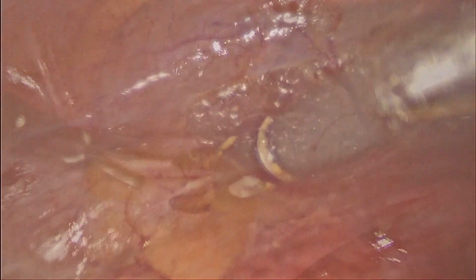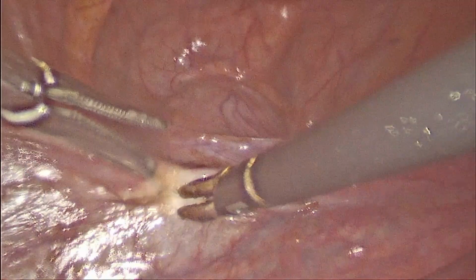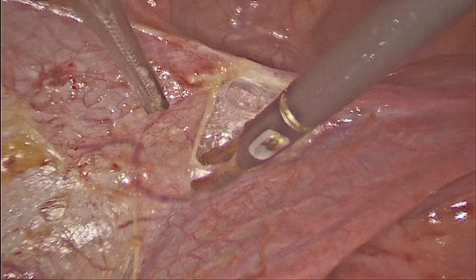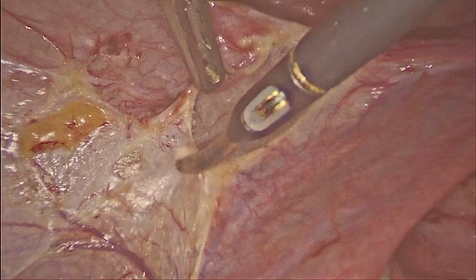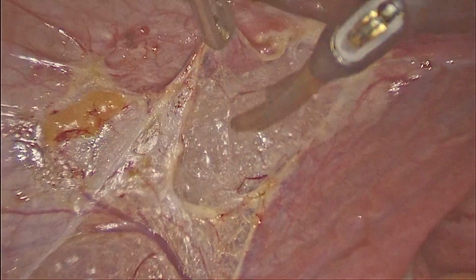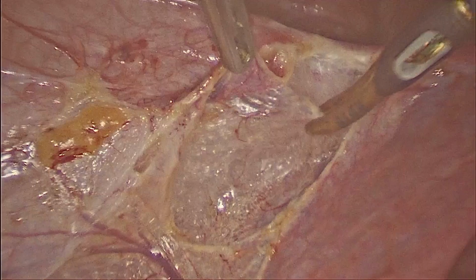Now we are going to the retroperitoneal area, and we are dividing the round ligament on the left side to get access to the retroperitoneal area, so that even on the left side we are able to identify the ureter and find the place between the infundibulopelvic ligament and the ureter. So this is the loose cellular tissue that is present in the retroperitoneal area.